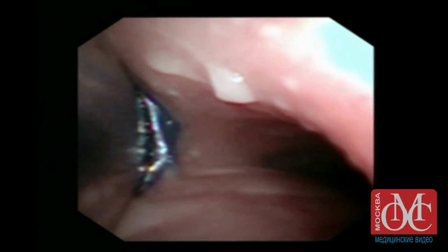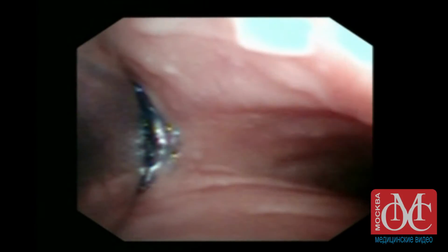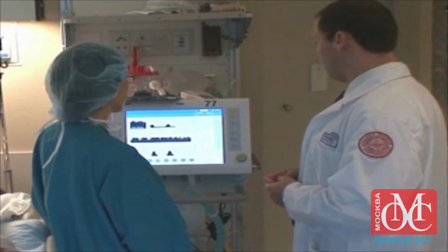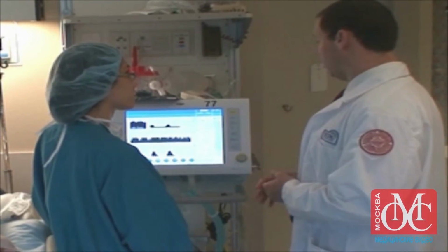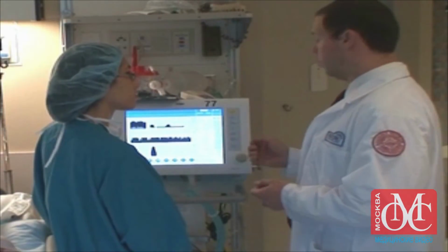In addition, a capnogram tracing indicates gas exchange and does not inform the clinician about whether the endotracheal tube is positioned properly. For example, whether it is in a bronchus or in the oropharynx. Capnography is useful for the measurement of the ventilatory characteristics of intubated patients, and it may reduce the need to measure arterial blood gas.